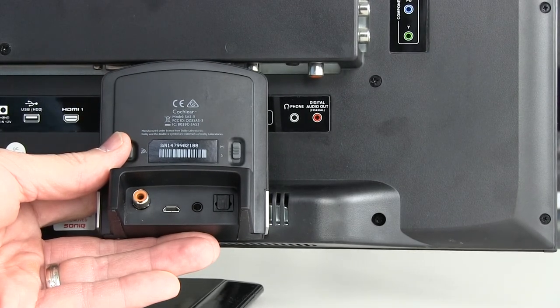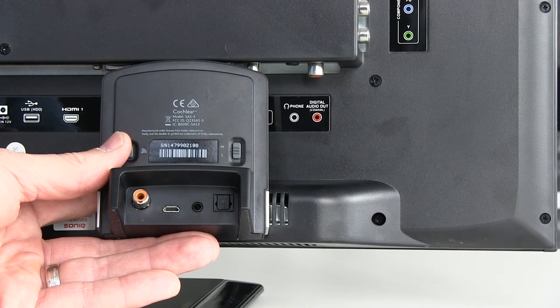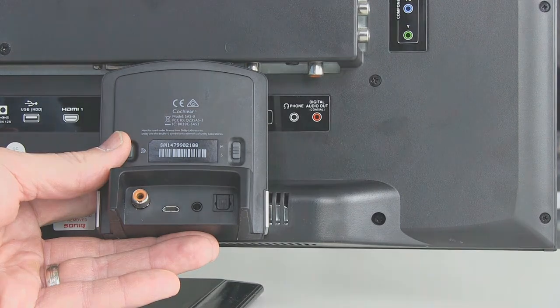When you connect with a headphone adapter, the TV usually cuts out the sound through the external speakers. So it's not recommended if you're watching with family or friends, because they would typically not get to hear the sound from the TV when you're using the headphone connection.